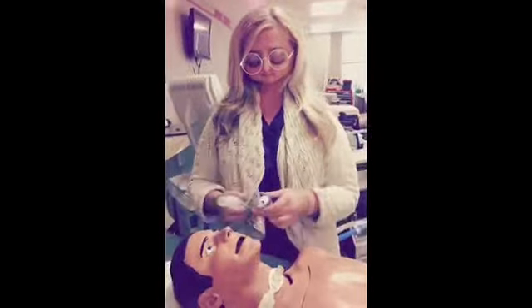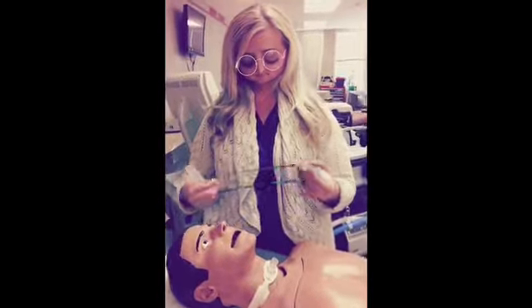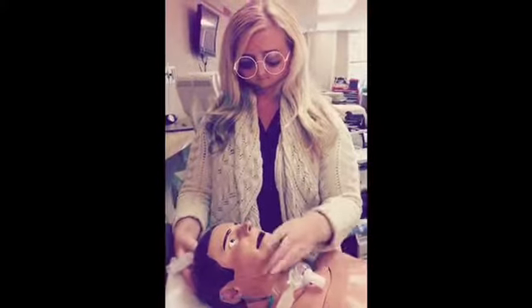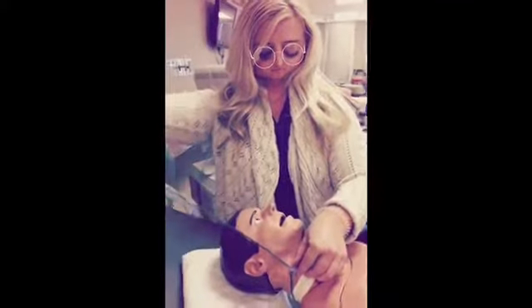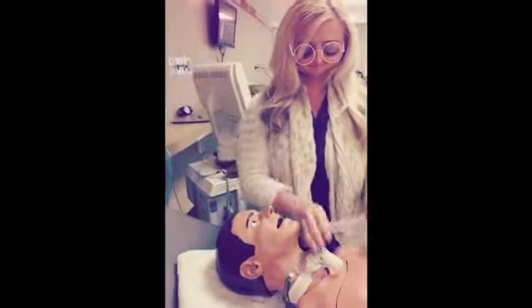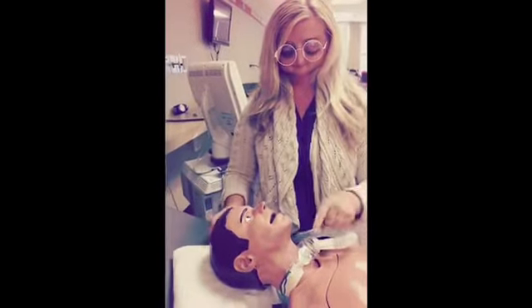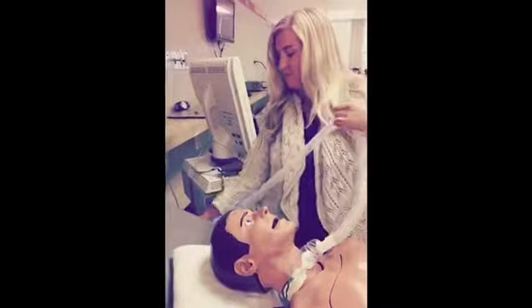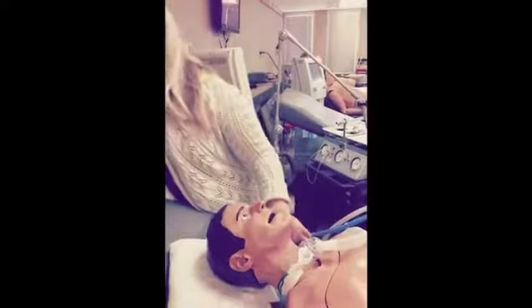Alright, so our wonderful respiratory therapist Alyssa here is going to be showing us a trach collar. What is this, you ask? It's a tracheostomy mask, sometimes referred to as a tracheostomy collar. It is a small mask that fits over the patient's tracheostomy site. An adjustable elastic strap that fits around the patient's neck holds it in place. The mask has an exhalation port that connects to the oxygen source with large bore tubing. The flow rate is usually set at 10 liters per minute with a nebulizer set at the appropriate oxygen concentration.